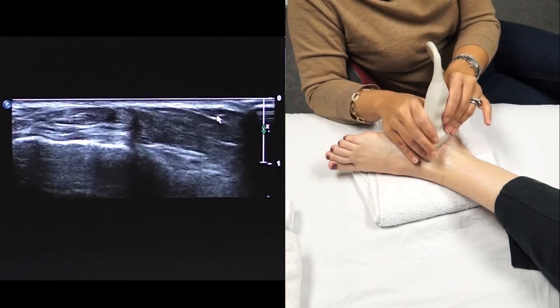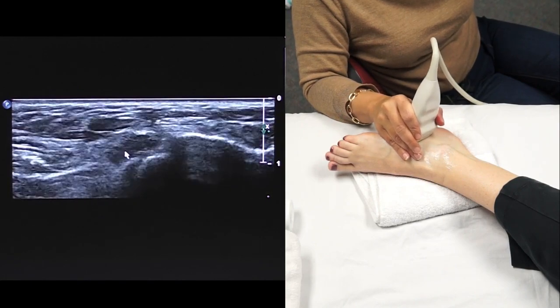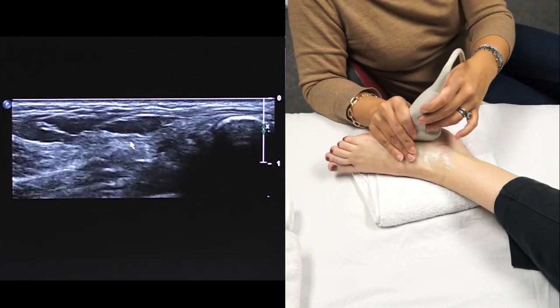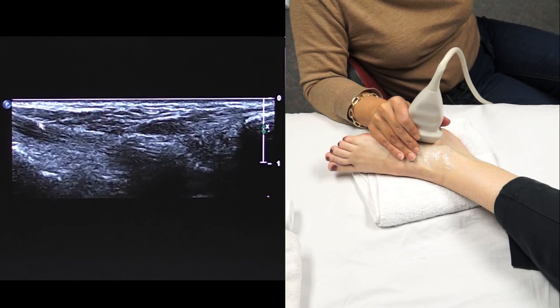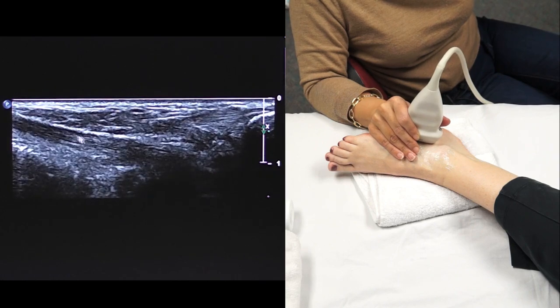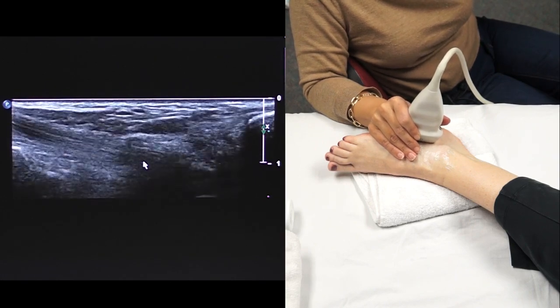The longus is more posterior, and you can see it here as it dives down and hooks around under the foot towards the first metatarsal. And you can also scan that and turn and see it in long axis. So here we see it. It is decreased in echogenicity due to anisotropy as it is diving down towards a deeper part of the ankle.